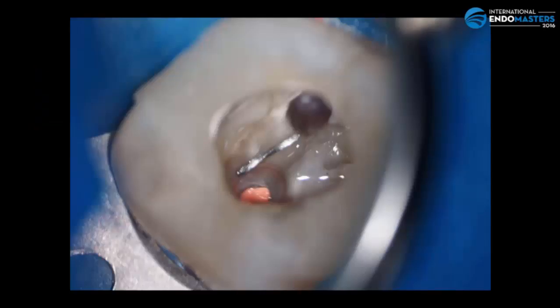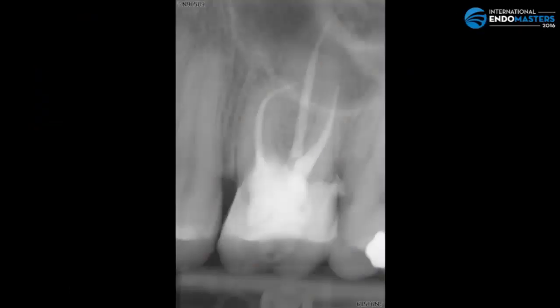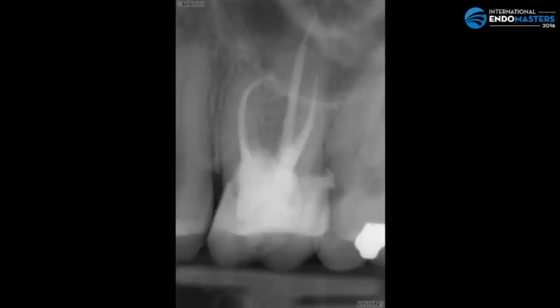I had to put my hands to work. I removed the second one, and finally I obtained the result using the TF adaptive file. After I started to analyze the case, I realized the distal root was the easiest to prepare. What is going to happen if I use the ProTaper in the mesial canal?